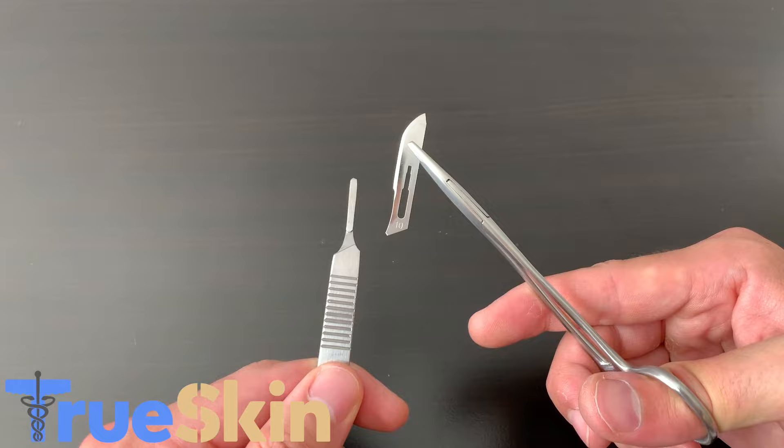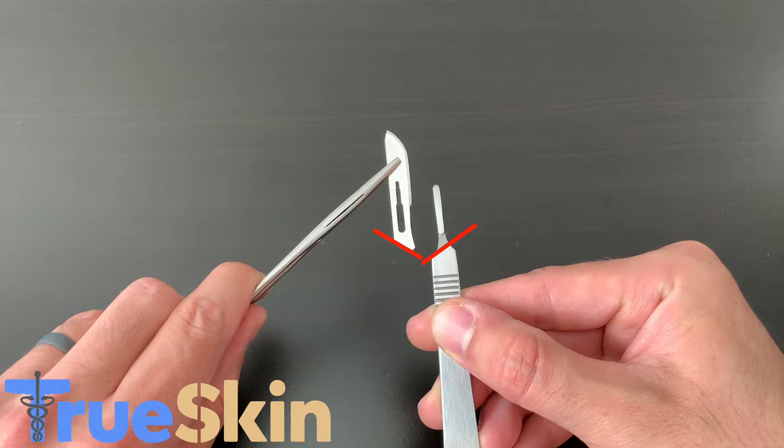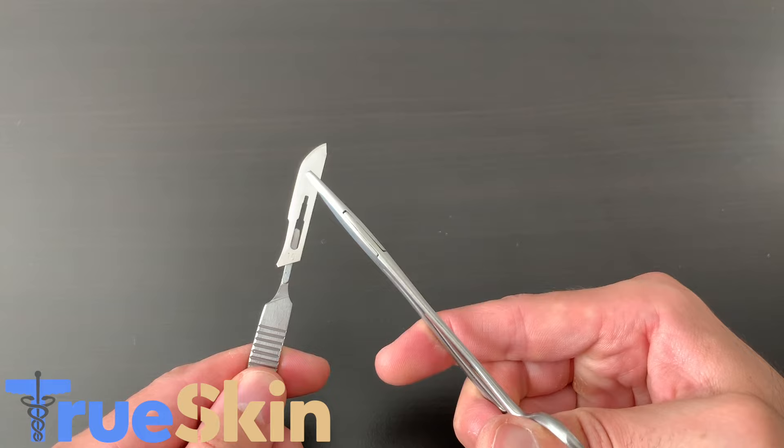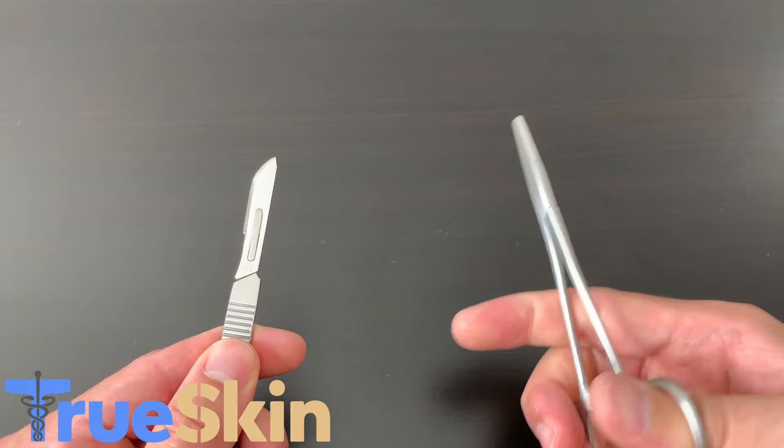If you have it the wrong way, you'll notice that the angles are not aligned and it won't fit. Once you have it the right way, go ahead and slide the handle into the slot. Once it's on the tracks, slide all the way down until it clicks. Now you have a secured blade ready for use.